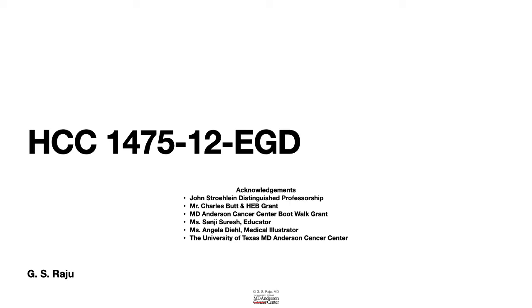Greetings. Let us learn about EGD, esophagogastroduodenoscopy. How do we set up? How do we pick up the right endoscope? And what are the indications for EGD? What are the contraindications as well as adverse events related to EGD?